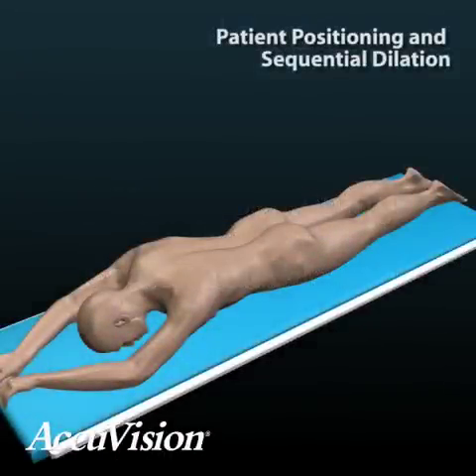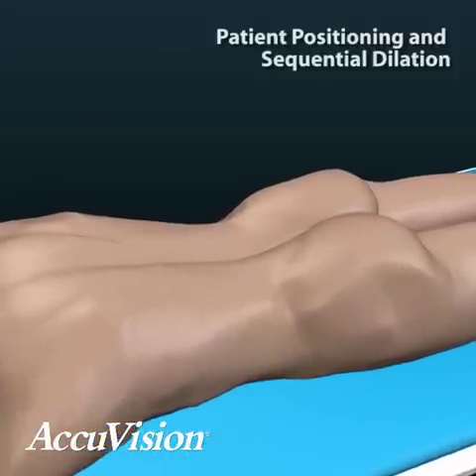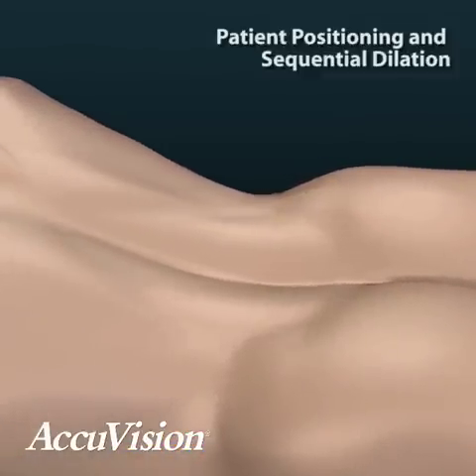The patient is positioned prone to provide the surgeon with adequate exposure to the posterior bony anatomy of the spine. As part of preoperative planning, the surgeon will determine the proper access point for the procedure by drawing a line on the patient along the midline of the spine and 2 to 4 centimeters lateral of the midline with the assistance of fluoroscopic imaging.